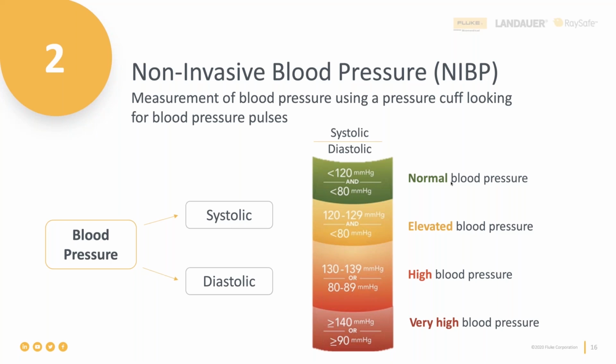So to sum it up, in terms of measurements, in a nutshell, we need to check NIBP devices for two things. The first of them is accuracy. Obviously, we need to make sure that the blood pressure measurement is being displayed correctly every single time, and that is repeatability, the every single time component of it. And obviously, an alarm check needs to be performed on a device too.